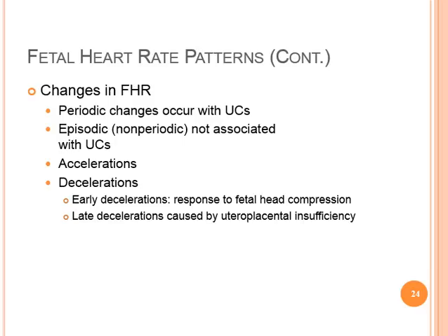Late decelerations of the fetal heart rate is a visually apparent gradual decrease in and return to baseline fetal heart rate associated with uterine contractions. With your late deceleration, the deceleration begins after the contraction has started, and the lowest point of the deceleration occurs after the peak of the contraction. The deceleration usually does not return to baseline until after the contraction is over. And we know that late decelerations have been attributed to uteroplacental insufficiency.